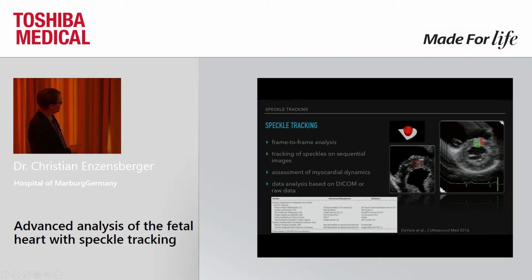The fourth point you can see here, data analysis based on DICOM or raw data.